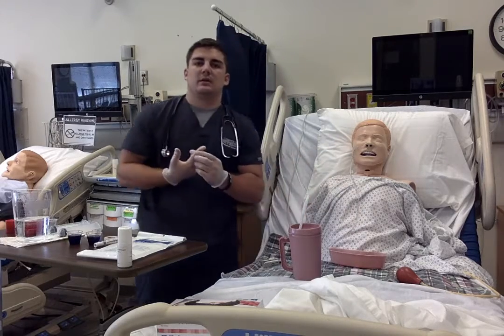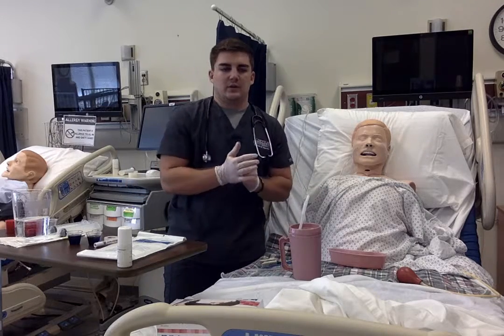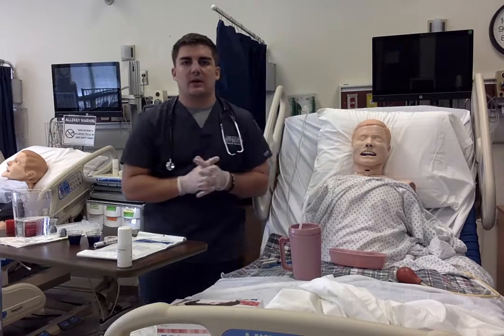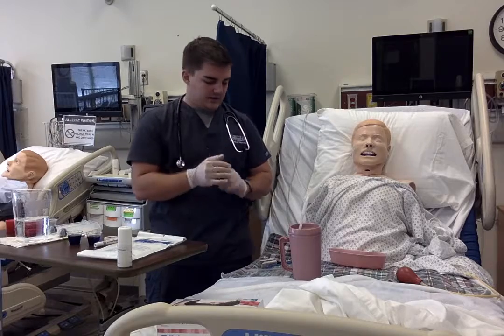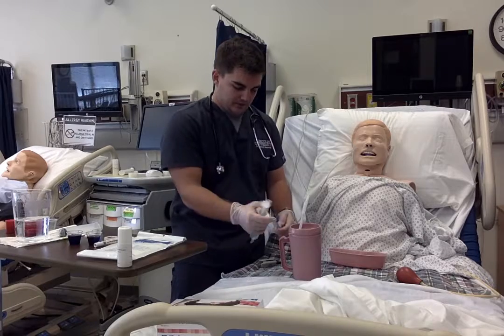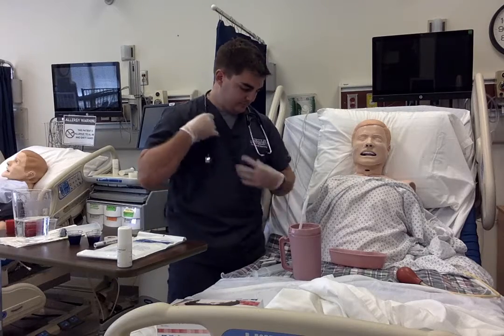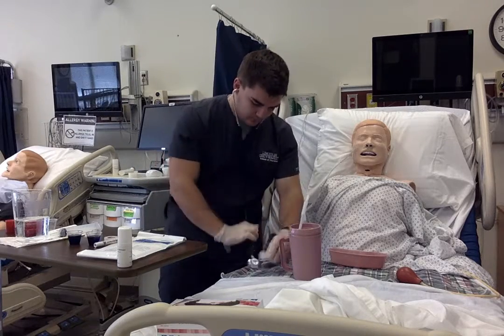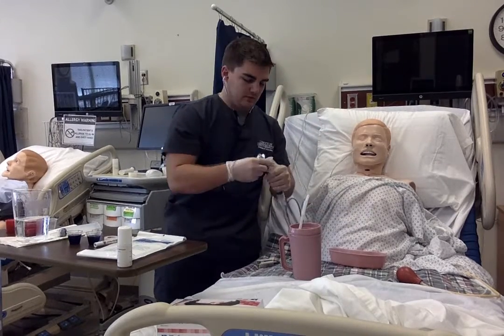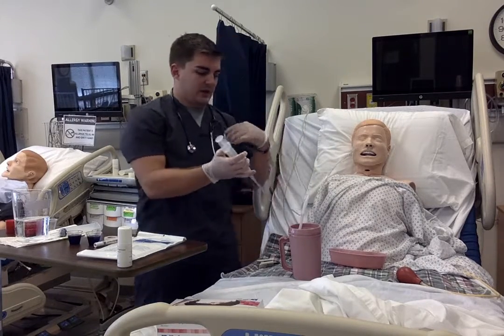Now that I have the tube inserted, I can temporarily attach it to the patient's cheek, and then I would check the placement of the tube. To check the placement, you can do three things. First, the guaranteed best way to check the placement is an X-ray. The second thing I can do is instill 10 to 30 mils of air into the NG tube and listen for a swooshing sound as I instill it. I'll push the air in and hear that swooshing sound for proper placement.